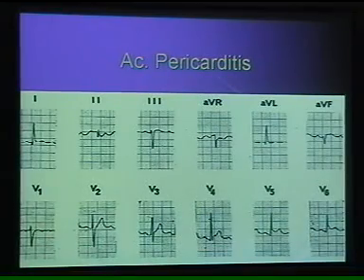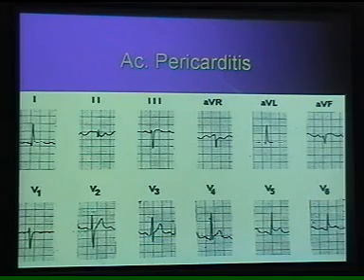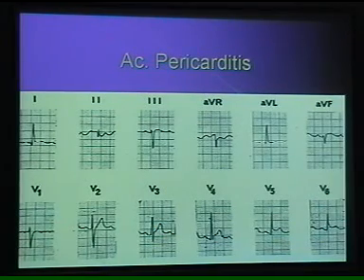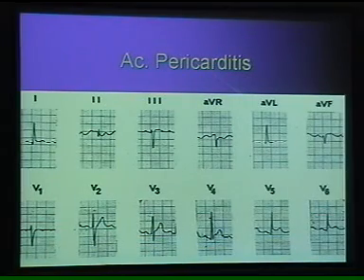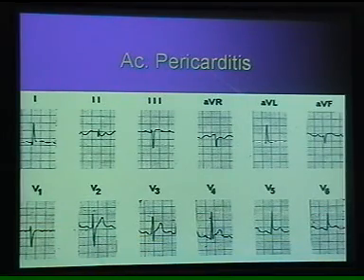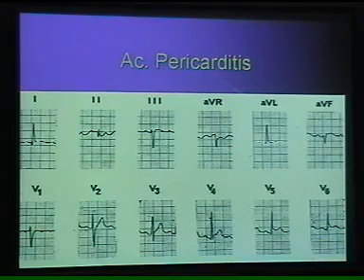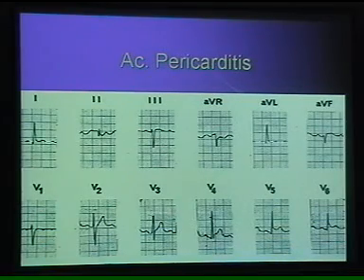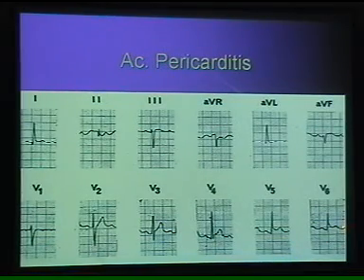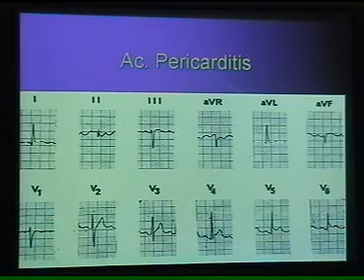That is one difference, and that is called a discordant ST segment change. Whereas the ST segment change in the same direction, like in pericarditis, is called the concordant change. So although there is ST segment elevation, the nature is different. And secondly, as you can see, this is concave upwards rather than convex upward as in myocardial infarction.